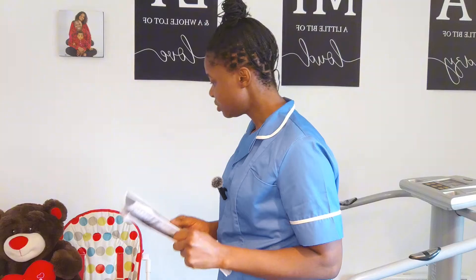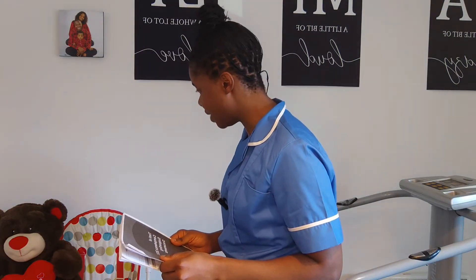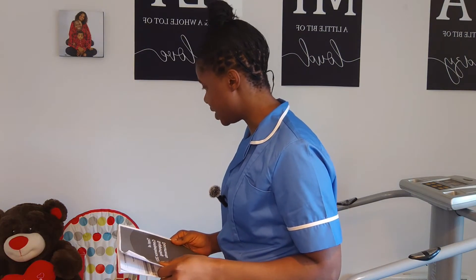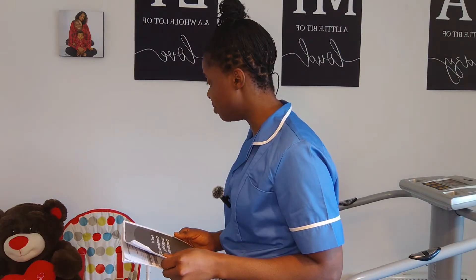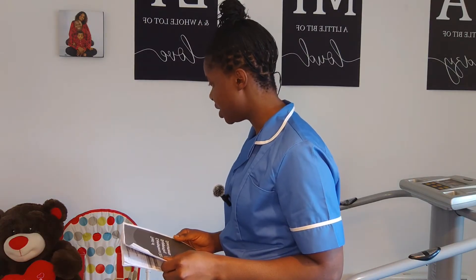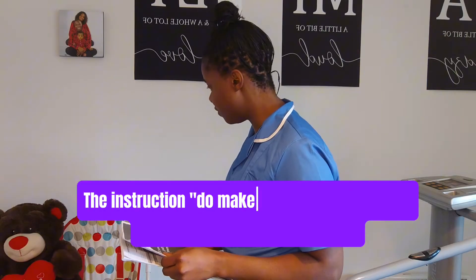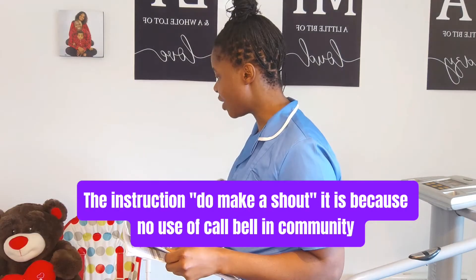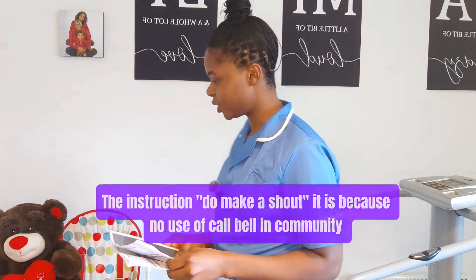Thank you very much. I will be stepping aside now to gather the equipment I'm going to use for the administration of the medication, and I'll be back shortly. Should you need me before my arrival, please do make a shout and I'll be right back.